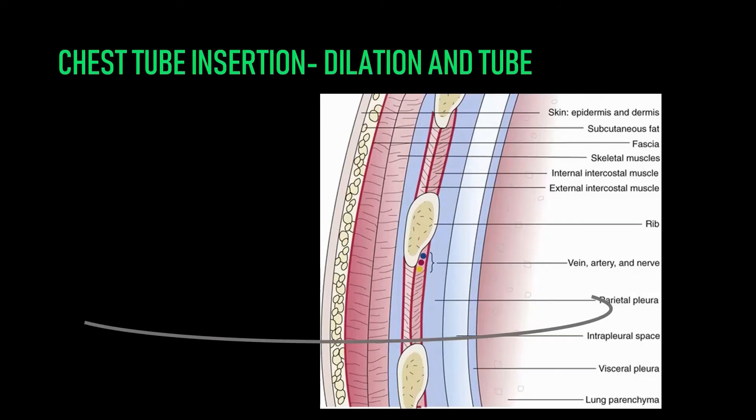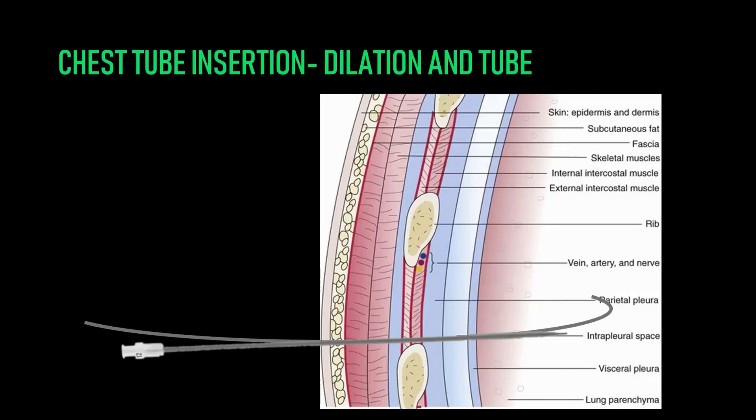Next is dilation. Take the dilator and run it over the wire until you hit the skin surface. As you begin to insert the dilator into the skin, advance with an assertive twisting motion. You don't need to insert the dilator all the way — just deep enough to get through the pleural space. If you're using a Thalquik kit with multiple dilators, do this fairly quickly in sequence.